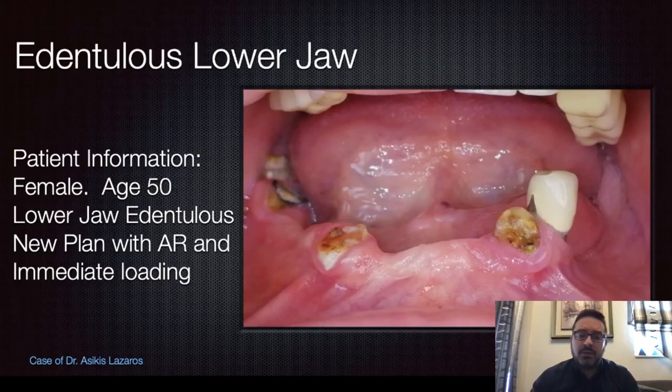So as you can see, we don't collect everything to our R2 lab. We're just letting the dentist decide what he wants to do, to whom he wants to cooperate with, and always we have the surgical guide printed by our lab so as to have the best results and be confident that we did the best that we could do for that case.